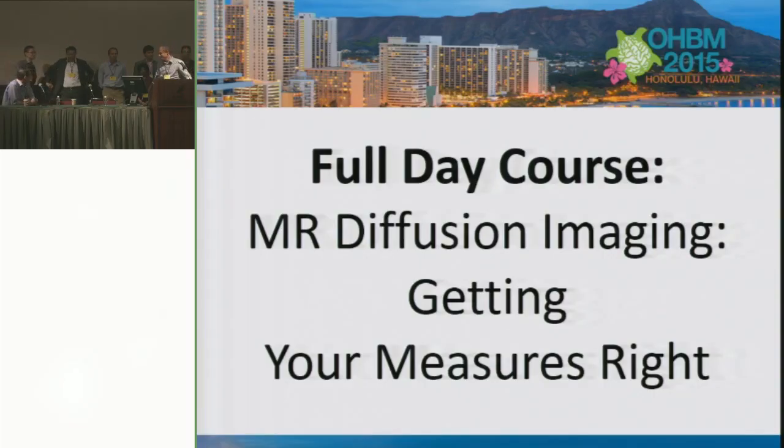Yeah, thanks. One more thing too. One thing that is definitely important is if you are comparing two or multiple groups and some of them are more susceptible to motion, that will have a statistical effect, and I think that needs to be understood quite carefully. There's a recent paper in NeuroImage, I can't quite remember the authors, about studies of children, where when you don't account for motion correctly, you actually find consistent changes across many different disorders. But once you account for that, many of these differences disappear. And I think that does need to be taken seriously.